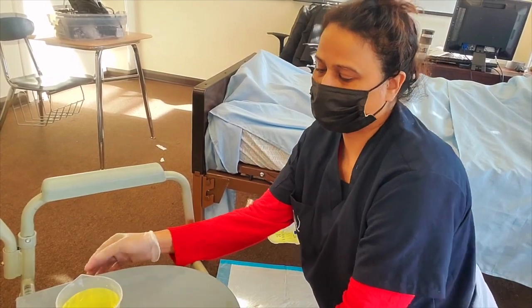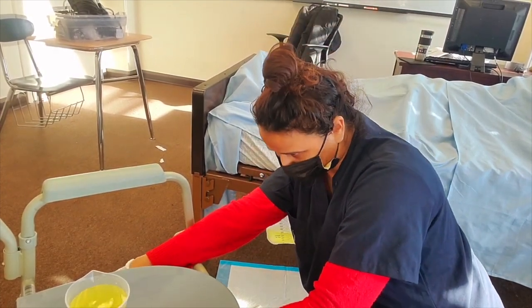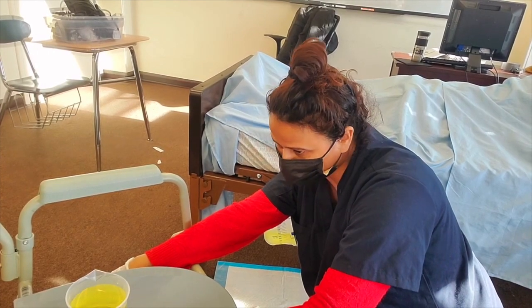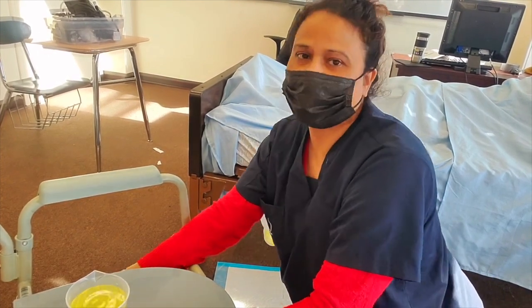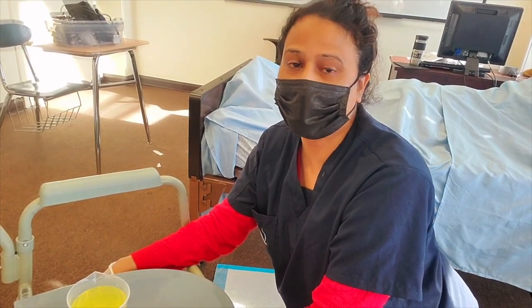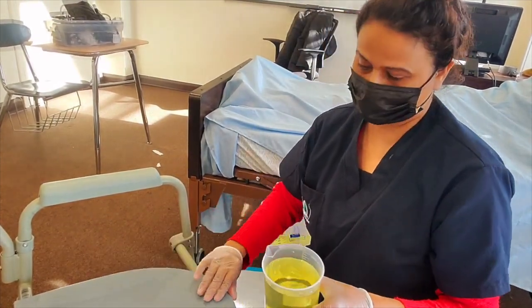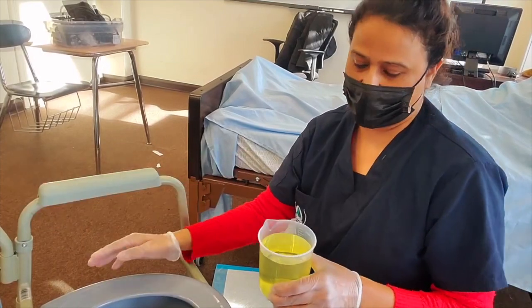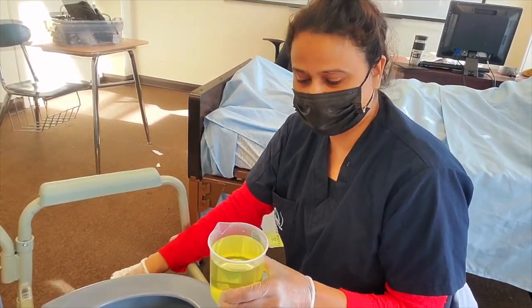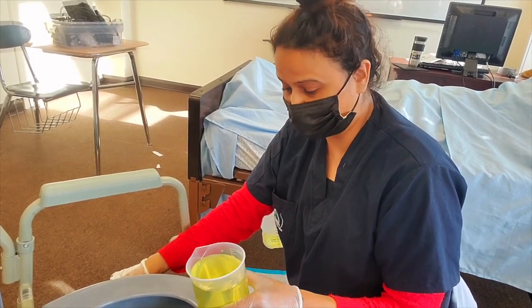You read the output at eye level. I have 480 cc's of urine output. You assess the color of the urine and check for any odor — is it concentrated?